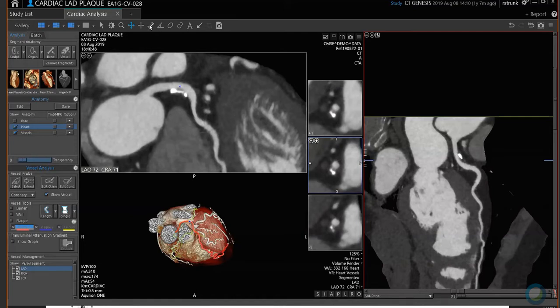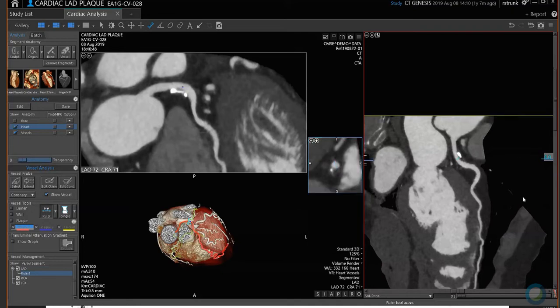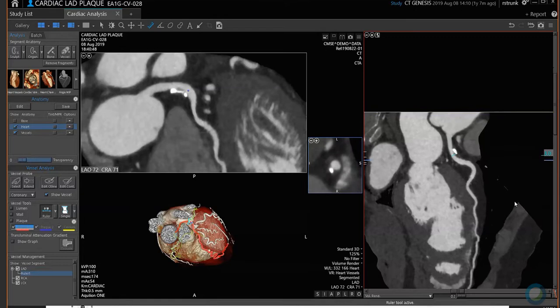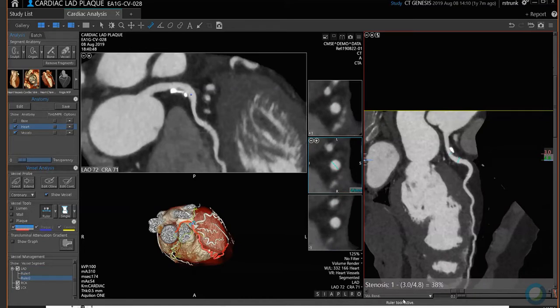These images are perpendicular to the center of the vessel. If you want to get your ruler to measure the lumen, go up to the main toolbar. You can measure by left mouse click and drag. If you measured the lumen at 3.0, then scroll to a normal vessel and do a second measurement, it will calculate the percentage of change between the two measurements. Under the LAD it puts down the rulers.